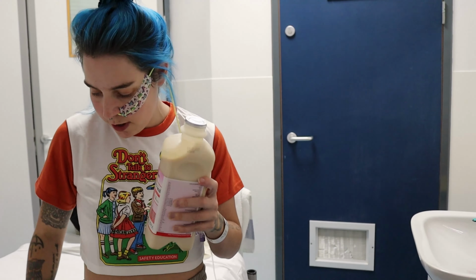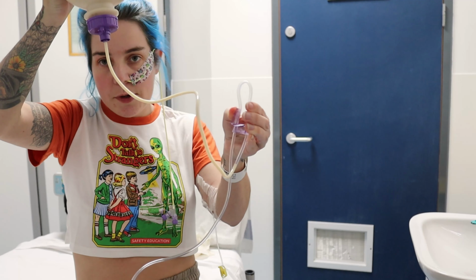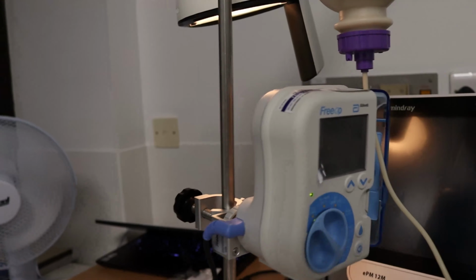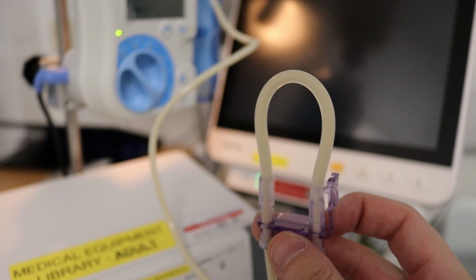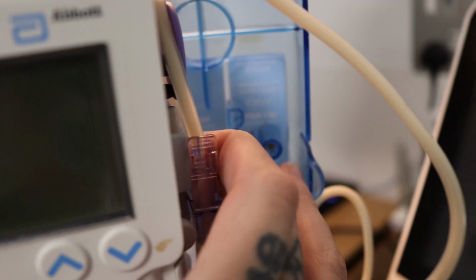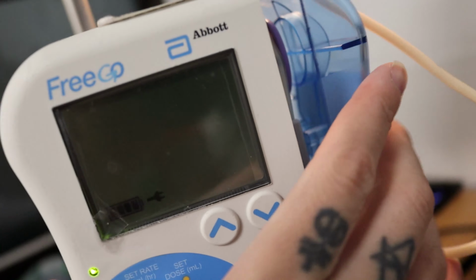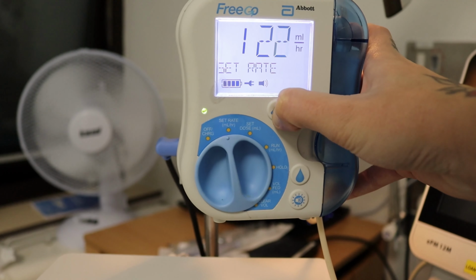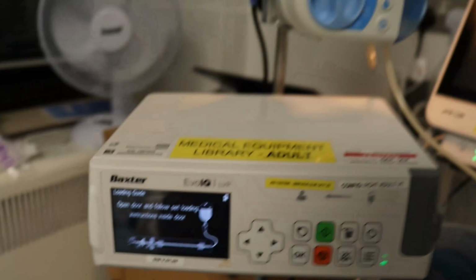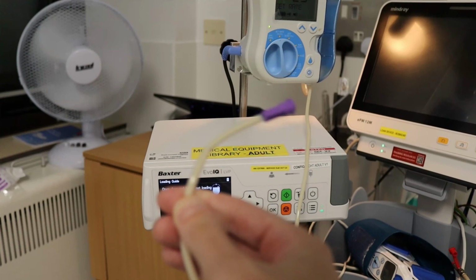It's got the feed bottle and the giving set. You want to pop a hole in the top of this one, attach this onto there, you squeeze these together and prime it. So you want to hook this one up, you want to grab this bit here, and we pop it in there, we pull that down like that, make sure there's nothing else in there. So we usually do 1, 2, 5, and there we go. And then when I chill out and plug that in, this goes onto the end of my tube here.